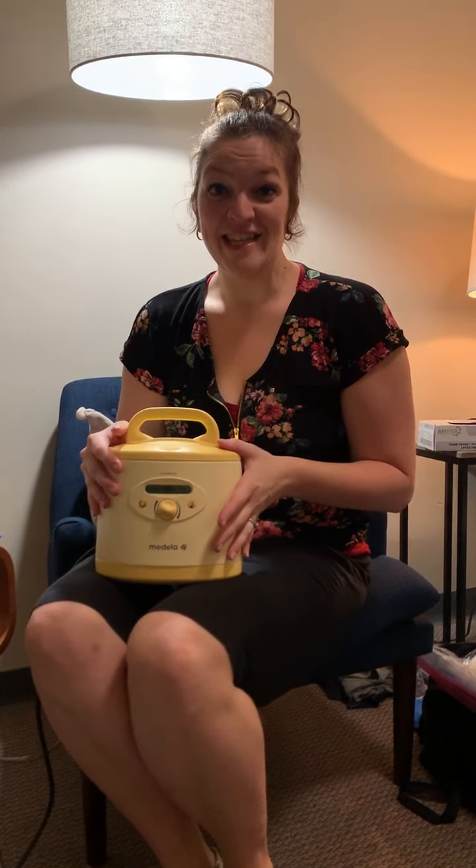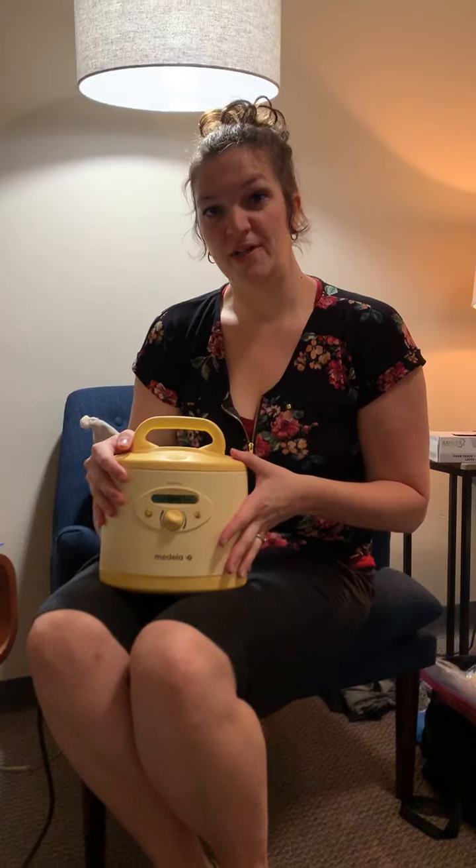Today we're going to be talking about the Medela Symphony. This is the hospital grade pump and one of the best pumps on the market for when you're trying to increase or maintain your milk supply.